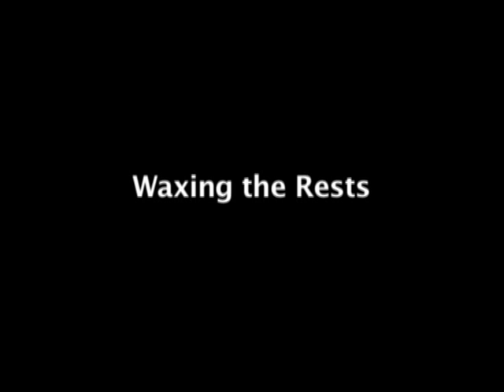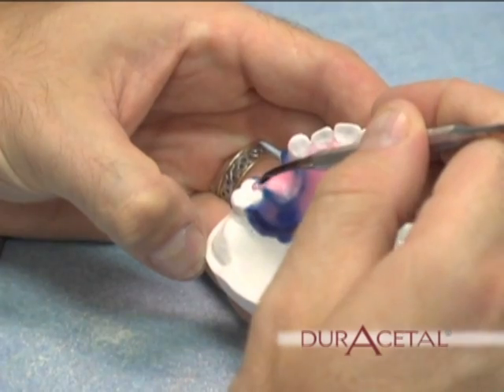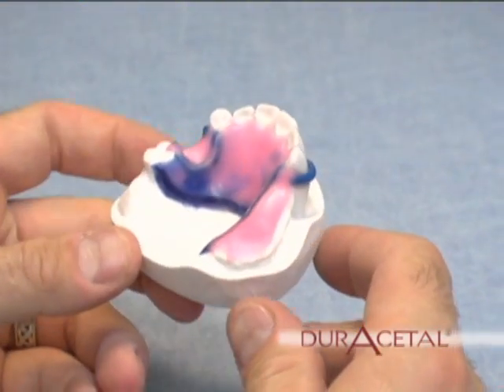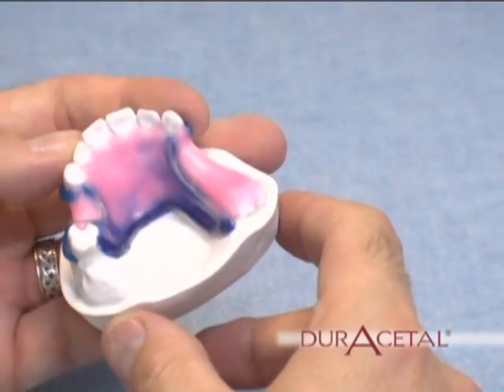Waxing the rests. With wax, fill in the areas requiring rests. Wax the rests thicker than needed before processing — they can be reduced after processing. Here is the completed wax-up.